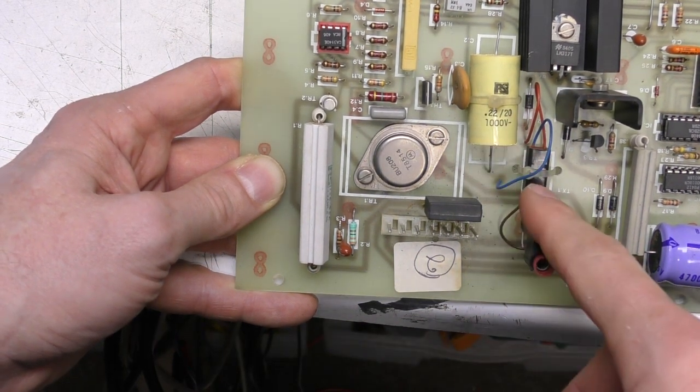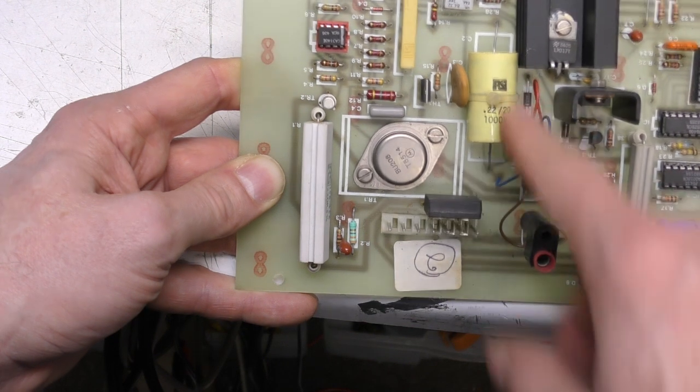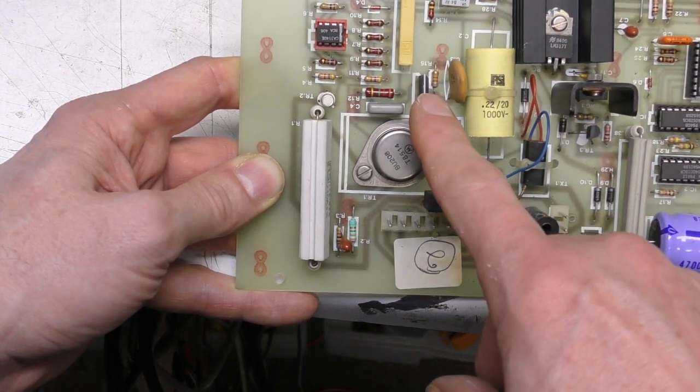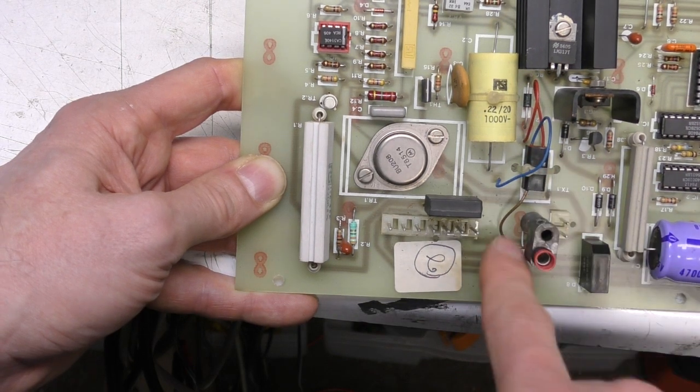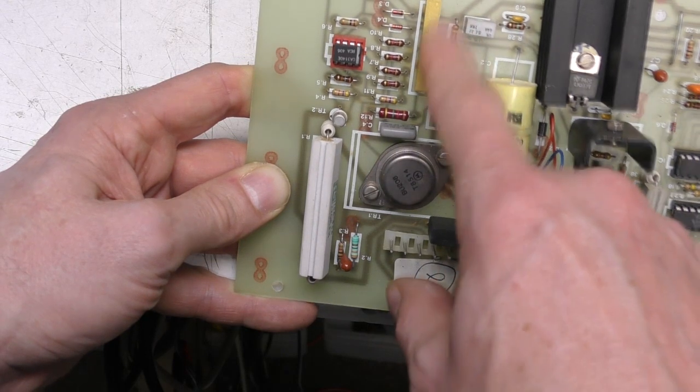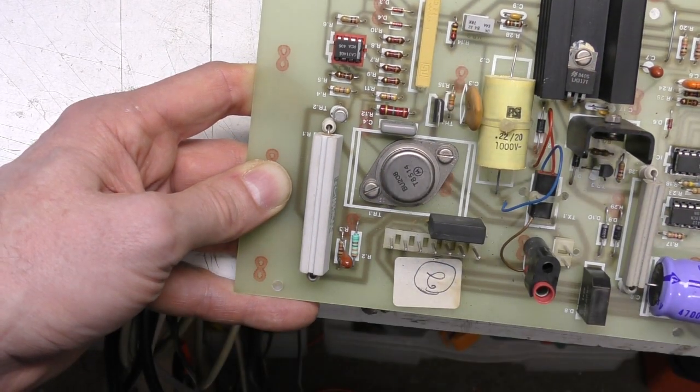And then there's a fairly traditional trigger circuit. We've got this capacitor here, which is then discharged through this thyristor into the trigger coil to produce that high voltage impulse to strike the tube. And some sort of adjustments here again. This is going to be for setting the charge voltage.